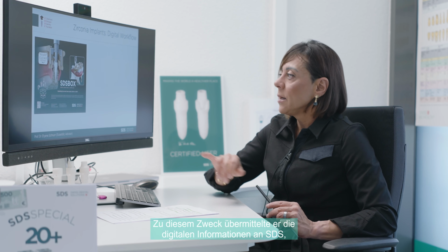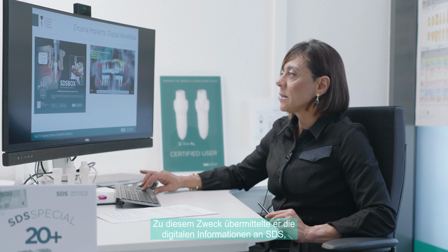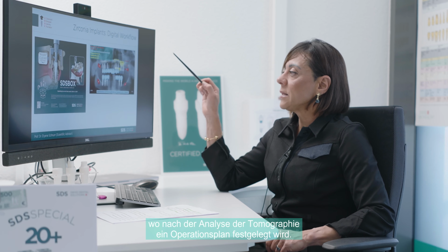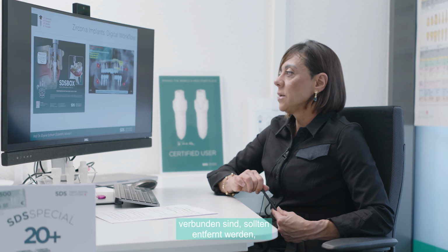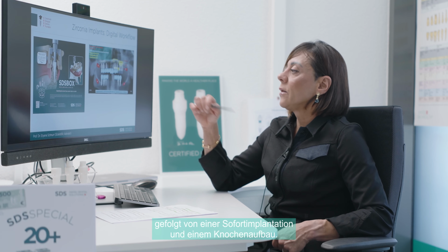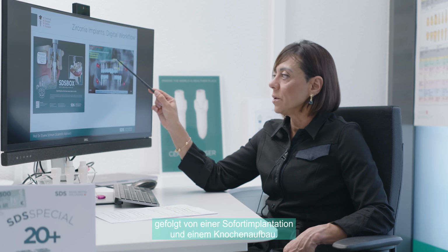To this end, he sent the digital information to SDS, where after analyzing the tomography, a surgical plan is defined. For instance, in this plan, teeth 16 and 46, both associated with periapical lesions, were planned to be extracted and followed by an immediate implantation and bone augmentation.